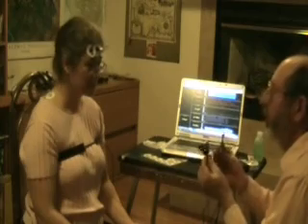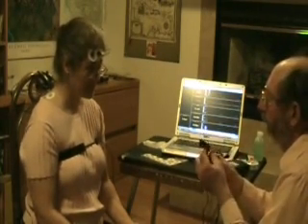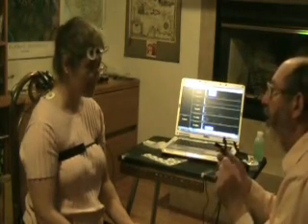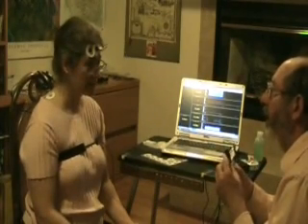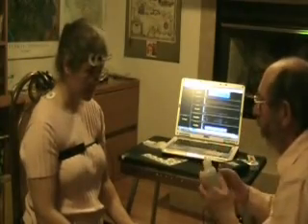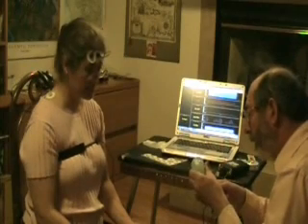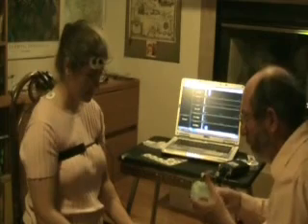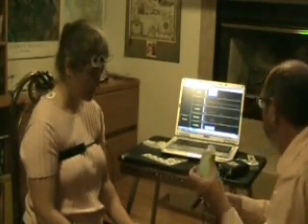These little sensors pick up how much you're sweating. And this device is going to send a tiny, tiny amount of electrical current to you. It's so little that you cannot feel it. And I'm going to put a drop of recording gel onto the sensor just to make it easier to pick up the tiny little changes in sweat.